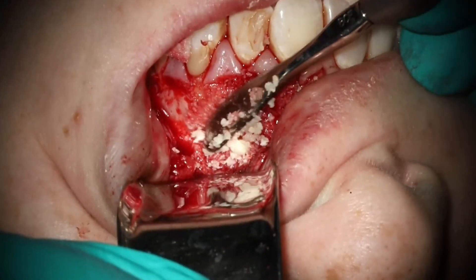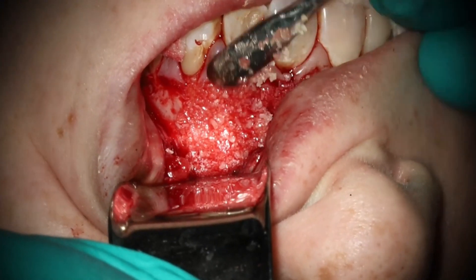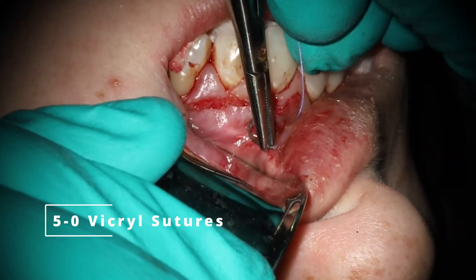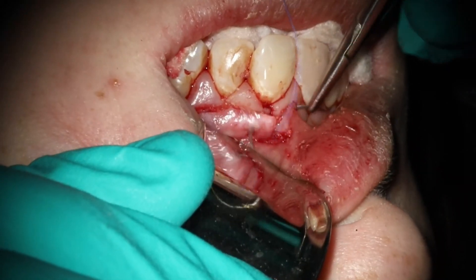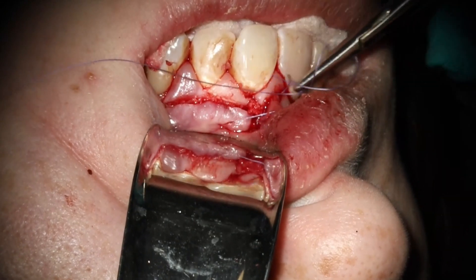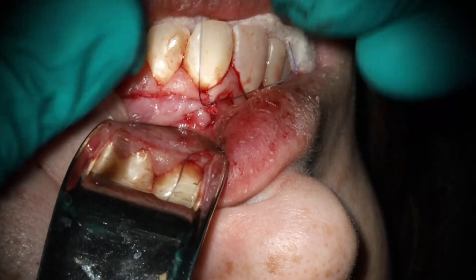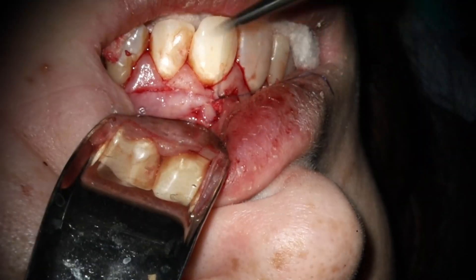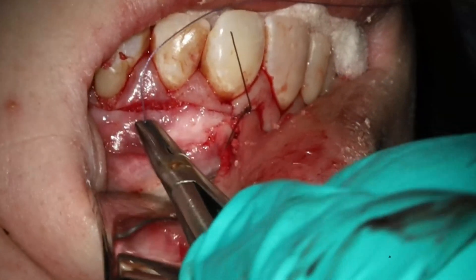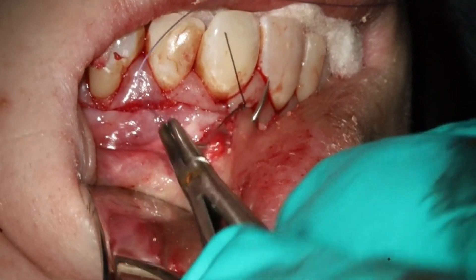One thing I did here was try to cover that root surface as much as possible. Without using a membrane it's probably not going to hold there, but it's going to be better than if I didn't. I used a full CC for this just because the size was so large. At this point we're going to go ahead and get the suturing done. Suturing this is not nearly as easy as the attached gingival flap — this took almost 15 minutes. I did a lot more singles rather than running locking like I would on the vertical.